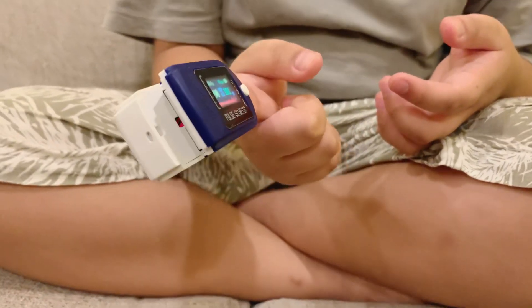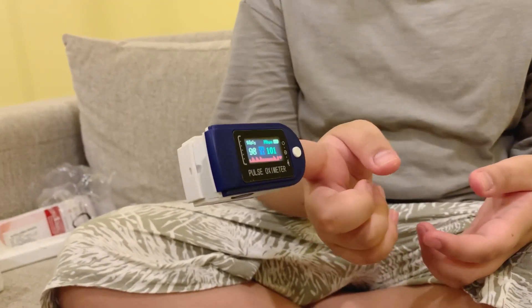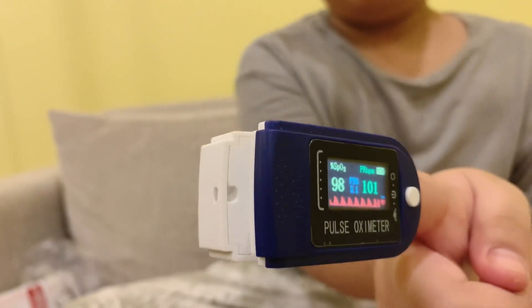It's at 98. Anything below 95 is considered low, so 98 is good. This is how you check if you're not well. Also, stay home, stay safe, and remain six feet distancing. See you on the next one, bye!